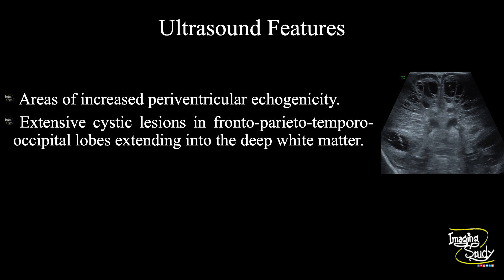So, in summary, periventricular increased echogenicity areas are seen. Extensive cystic changes are noted involving the frontoparietal, temporal, and occipital lobes, extending up to the deep white matter. These features conclude this as a case of periventricular leukomalacia grade 4.